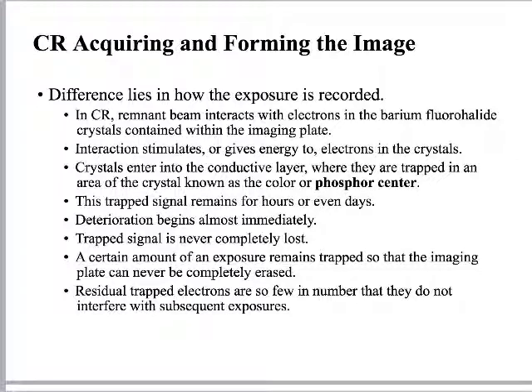CR is actually more sensitive than film. But we leave CR cassettes just out and about at the department, right? It's more sensitive than film to X-rays, to background radiation, all that. The reason why we can leave it sitting out is because the digital system cleans up all that noise. It gets rid of all that for us. With film, you couldn't clean it up. If it's there on the film, it's there.